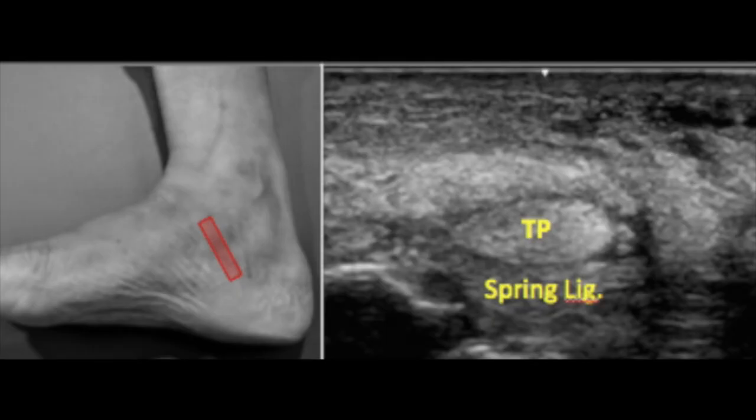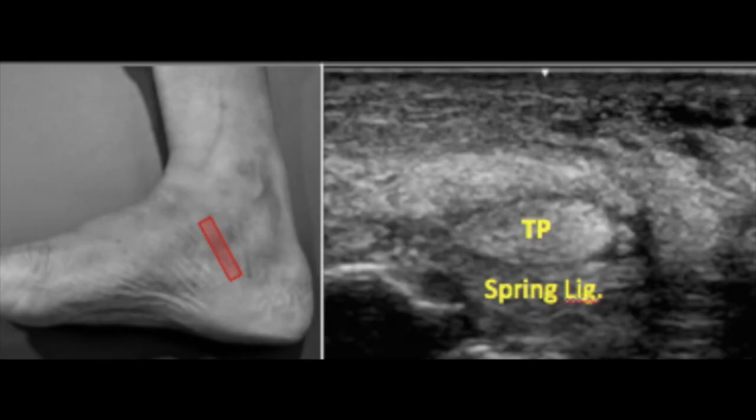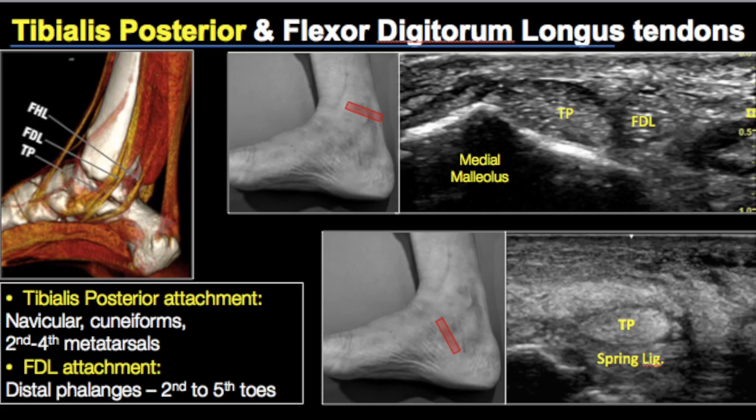On the short axis in the inframalleolar segment, just below the tibialis posterior, we see a broad cord-like structure — this is the spring ligament. When evaluating tibialis posterior dysfunction, it's important to assess the spring ligament as well, since after failure of the tibialis posterior tendon, it's the spring ligament which gives way and contributes to the loss of the medial arch of the foot.